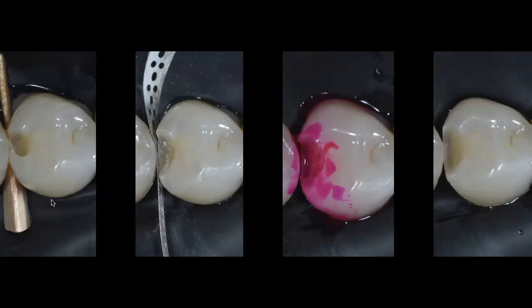But by using these lightning strips, you can also remove the enamel very conservatively and create, as you can see, a very nice and clean enamel. And also you can bevel the walls using this same strip, or even using a mosquito burr if you have enough room for it. But this is a really good tip that helps you be as conservative as possible at the time of your preparation.